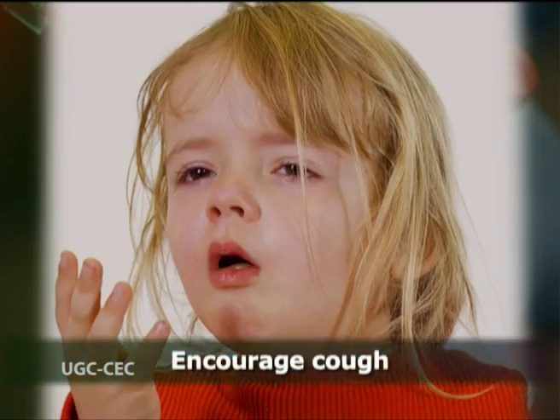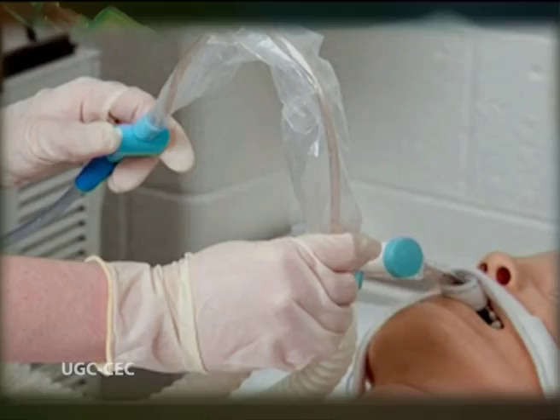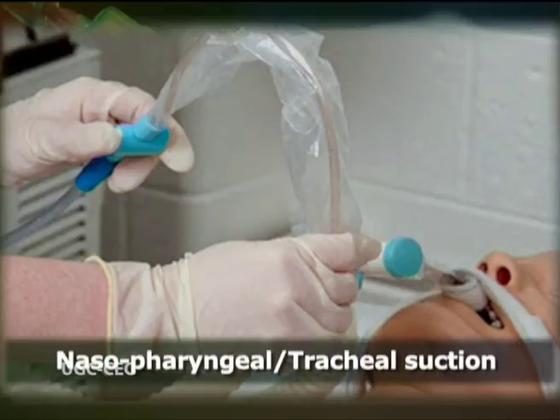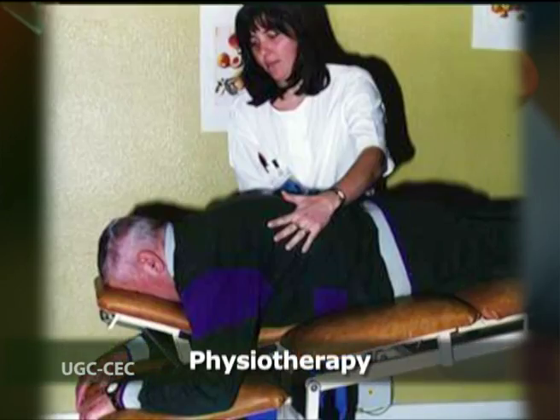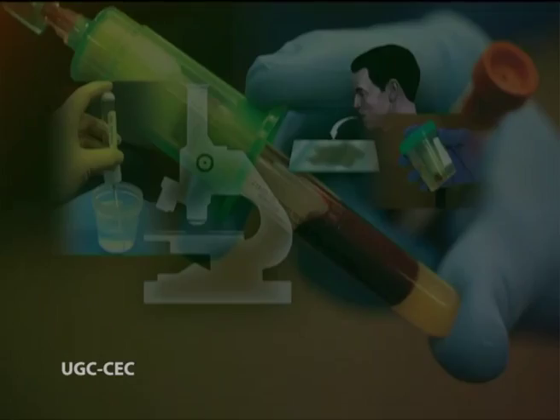Encouraging the child to cough, especially after sleep, and expectorate into a container. Alternatively, a poorer sample may be obtained, as from nasopharyngeal or tracheal suction. Using a sputum trap can be undertaken. Physiotherapy may help to facilitate expectoration. Ensure the material obtained is sputum and not saliva.